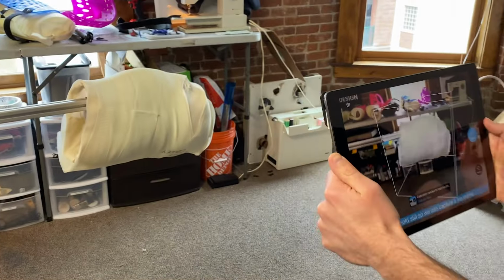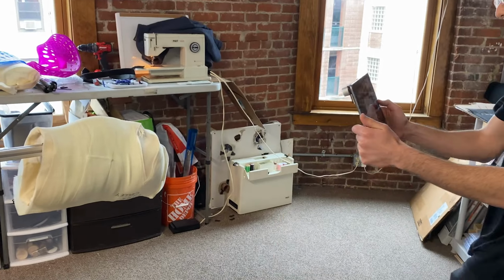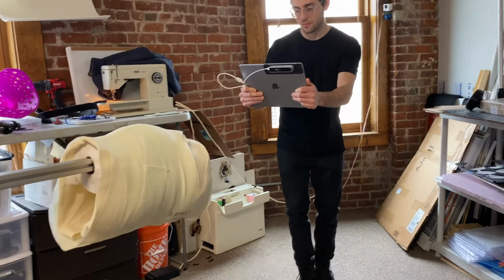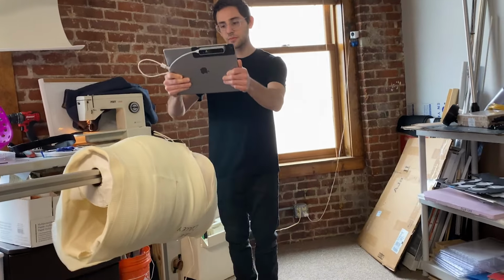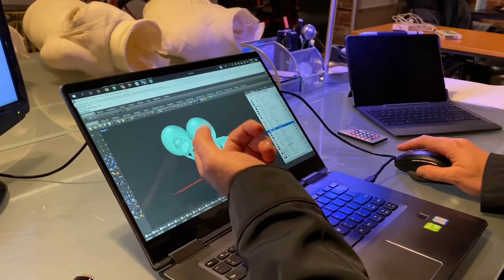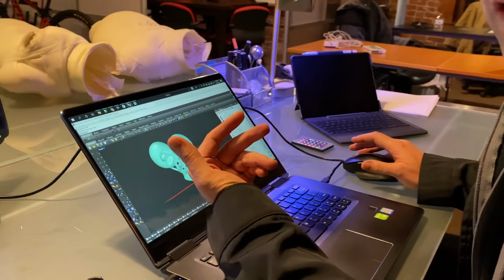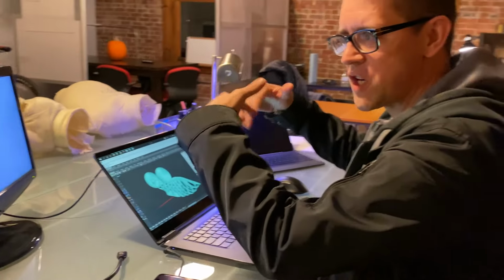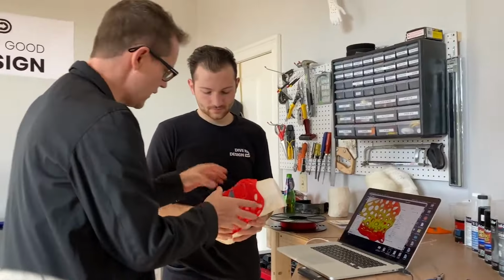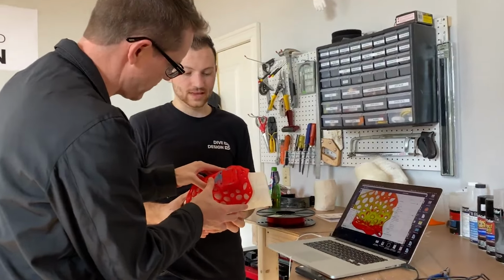So what we do using 3D scanning and 3D printing is we take an image of Sally, we scan her whole body, we scan her torso, her sides, we bring that scan into our computer and we sculpt it digitally. We use a tool called Mesh Mixer that allows us to sculpt it as if we were using clay, but in the computer. We then get that file and we 3D print it, and it allows us to create a jacket for Sally. So we create something like this in the computer, right?